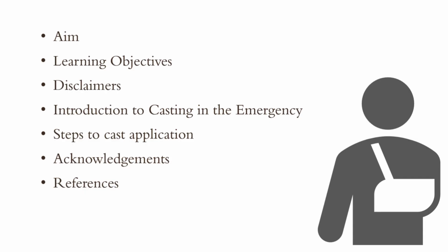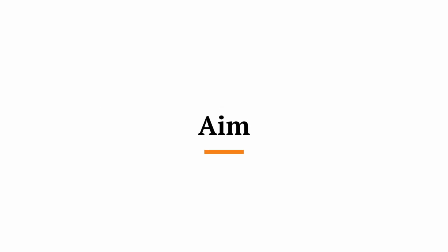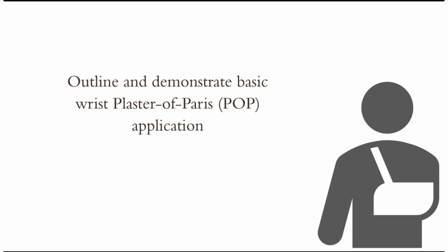This video will outline the aims, learning objectives, disclaimers, introduction to casting application in emergency, step-by-step of casting application, acknowledgements, and references. The aim of this video is to outline and demonstrate basic wrist Plaster-of-Paris, or POP, application.